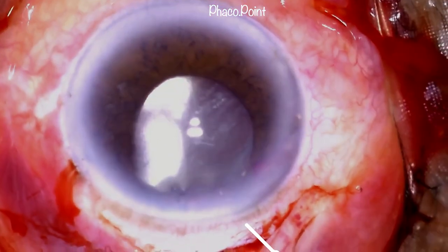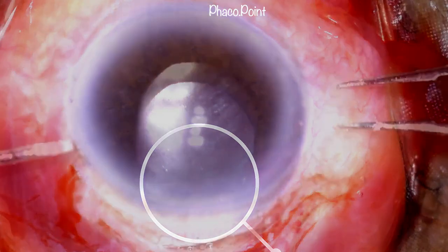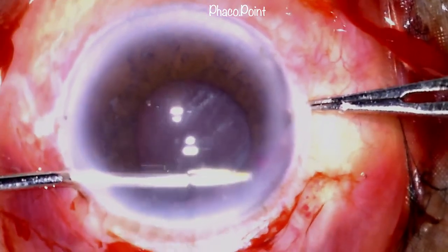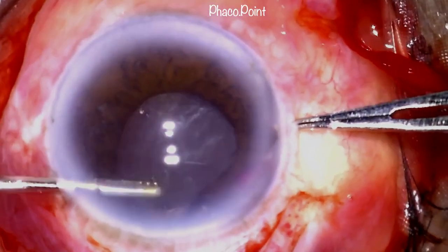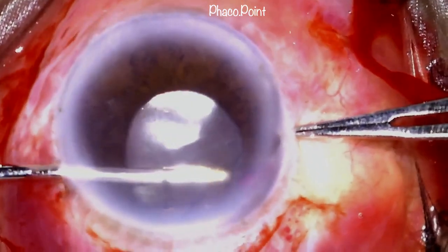We now move to address the missing iris. Clearly, the iris doesn't seem to have prolapsed through the wound, so could it be stuck within the scleral tunnel? Under viscoelastic cover, and after affording adequate counterpressure, I use the intraocular forceps to pull on the iris and I'm able to successfully draw it out from within the scleral tunnel into the anterior chamber.